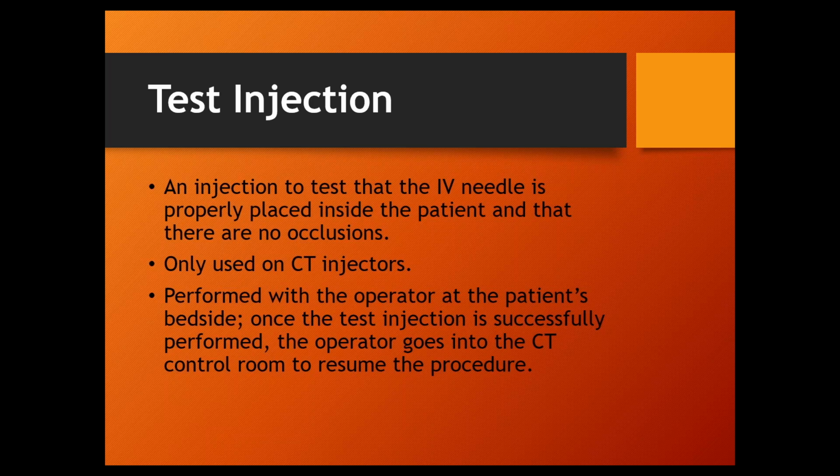All right, if you'll look here, let me go to phase 2. I don't know if you can see this, but in phase 2, that test injection option is not there, because test injection is only an option on phase 1. It's not available on any other phases.